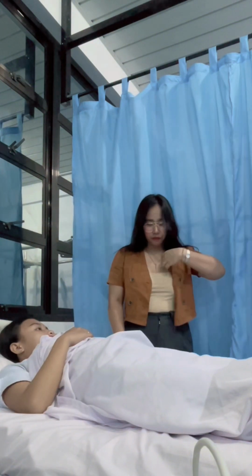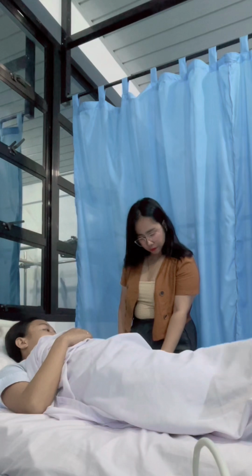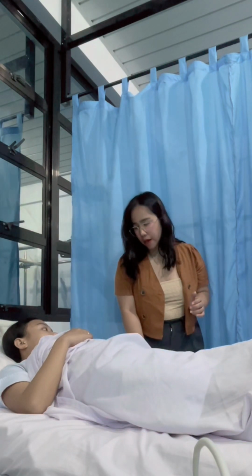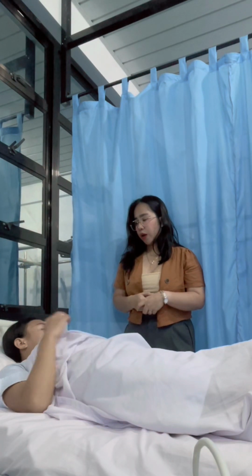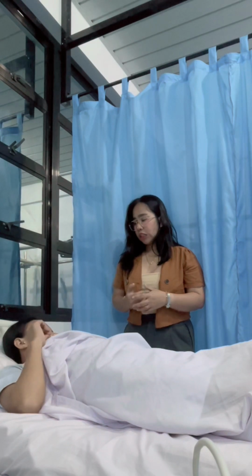And then, okay, ma'am. I'm Charmy Piozoa, ma'am, and I'm your student nurse for today. And I will be going to assess your respiration and oxygen saturation.